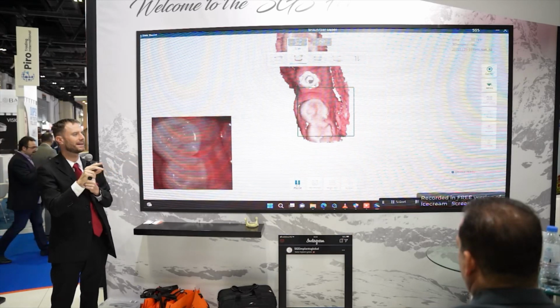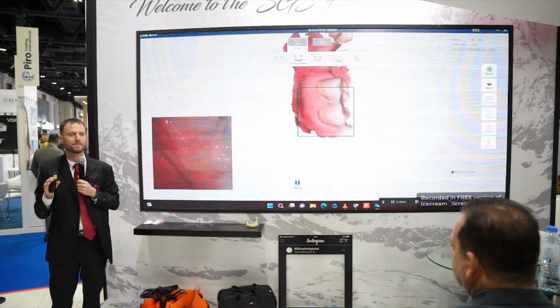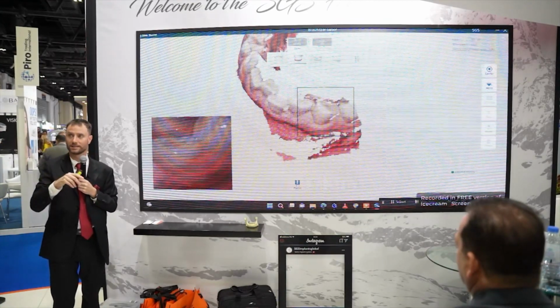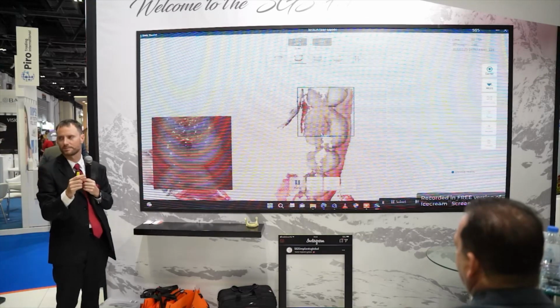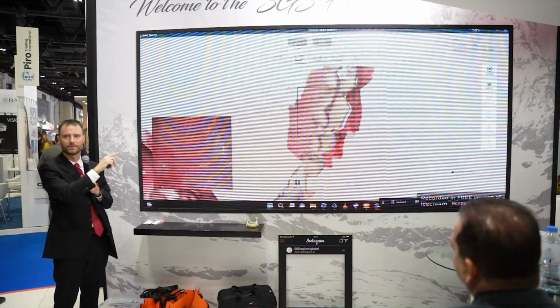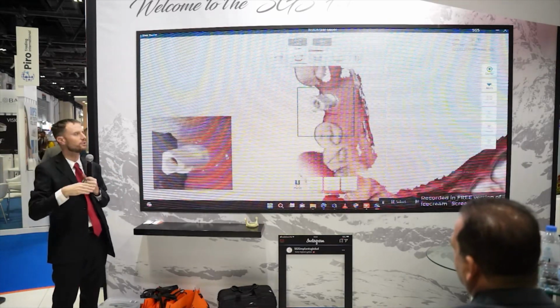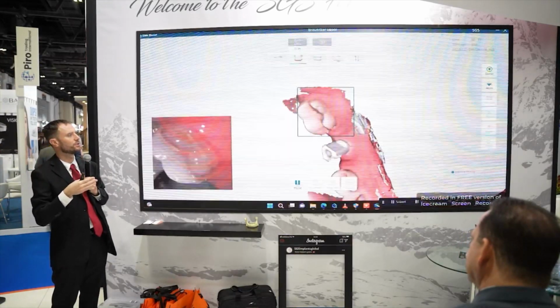We don't have sound from that. It's like a snow cracking sound. Some have a weird sound. I prefer the sound of this one more, you will hear soon. And it's quite good. All scanners are good in scanning. The question is when they lose the situation, how quickly they find themselves. I think this one is very quick. You see it lost and it finds itself in a few seconds. It's always a critique when you change your movement, how quickly it finds its way back. That's the issue. You don't want too much data again. You just need enough data so you can do the scanning.